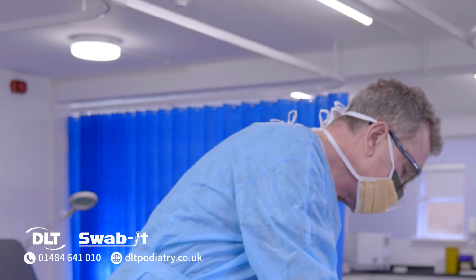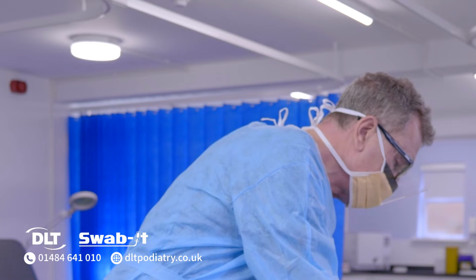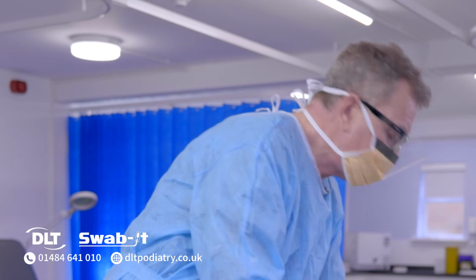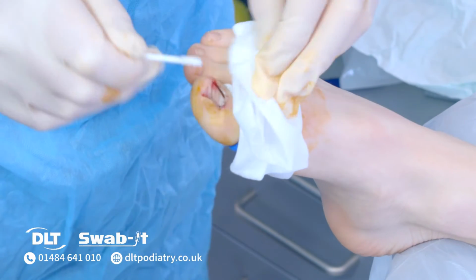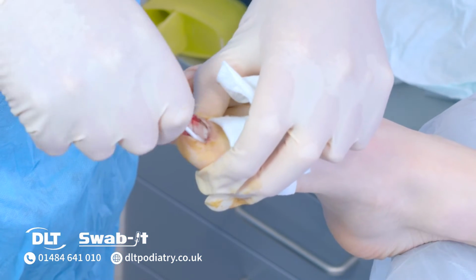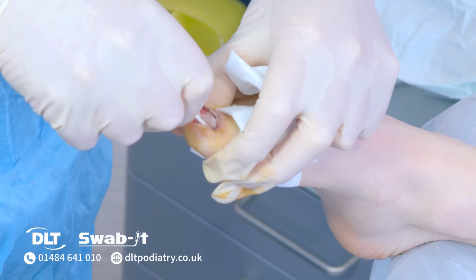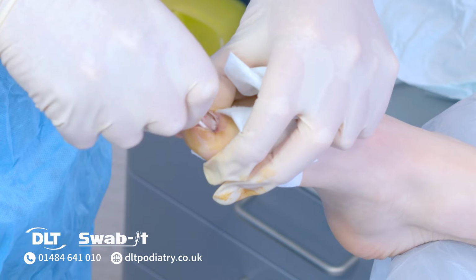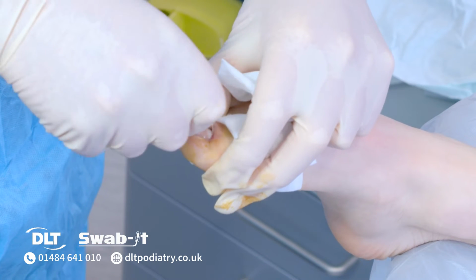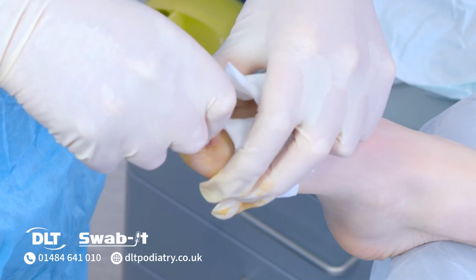There are lots of trials recently, randomized controlled trials, that have demonstrated that using 2 1-minute applications does not affect the outcome. Today we're going to use 3 1-minutes because this young man has had a couple of regrowths. So we really want to make sure he has the best chance of having a successful procedure.